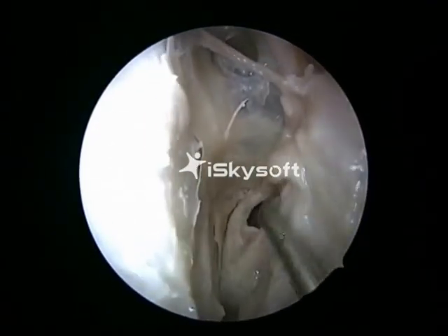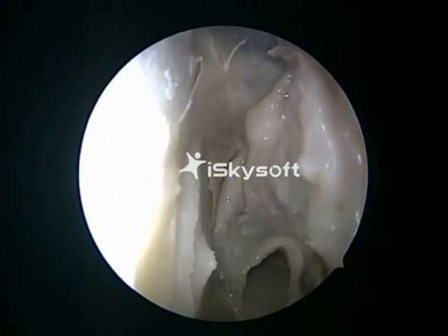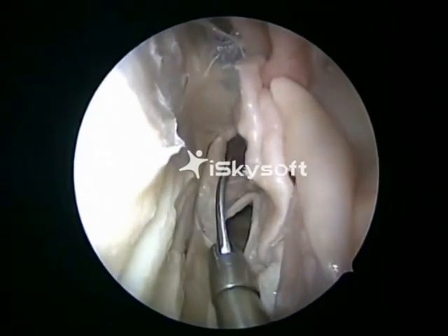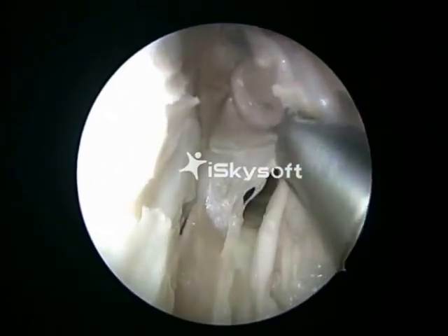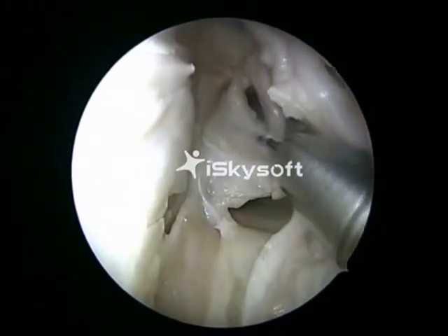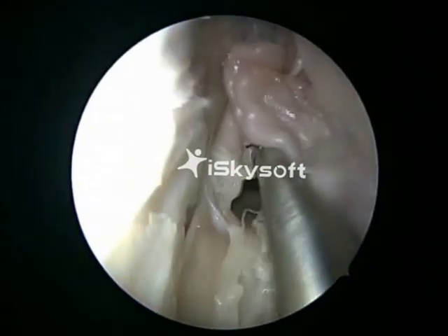That's a choana. And sharp dissection should be used here. And we secure this flap in the nasopharynx. Tissues were a little bit rubbery because it's a cadaver.